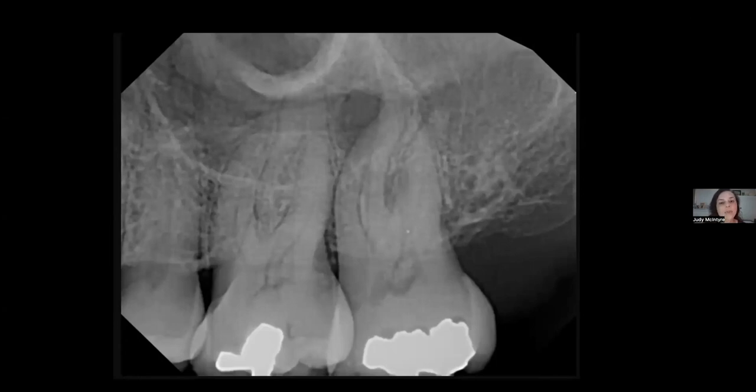This was a case that was referred to me. Now, I've been practicing for 2 decades now. I was trained with periapical images, 2D x-rays, and from that, I was trained to do endodontics and save teeth. So of course, let's start with a 2D image.